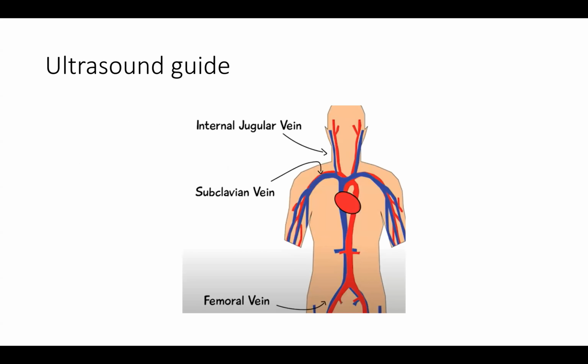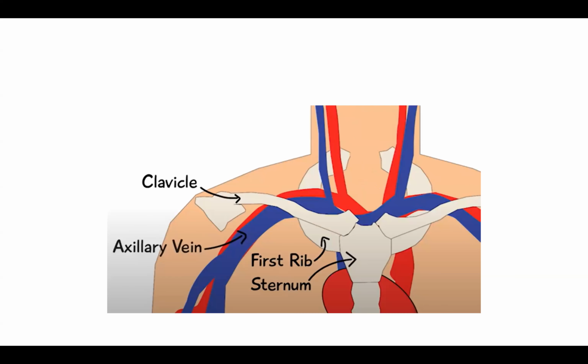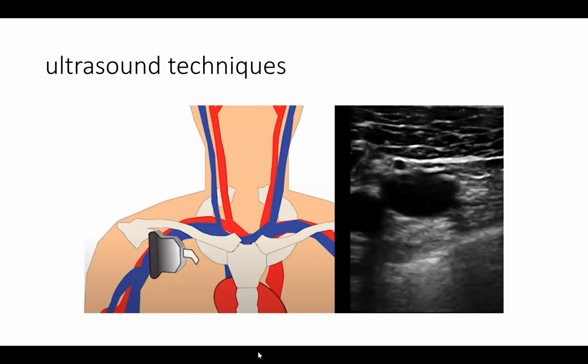So in the ultrasound guided, either you do it from the left or from the right subclavian. The first thing that you do here, you can see the probe at the corner here. You take the probe the way it is, looking towards the shoulder, and a linear probe, and scan it through.